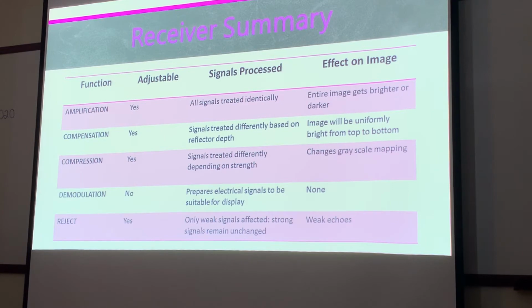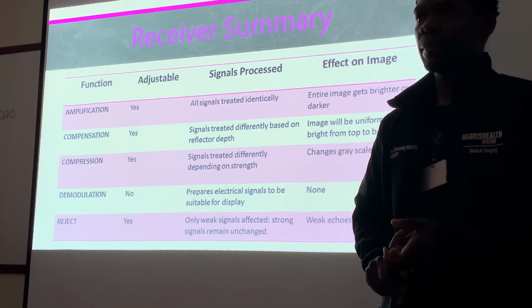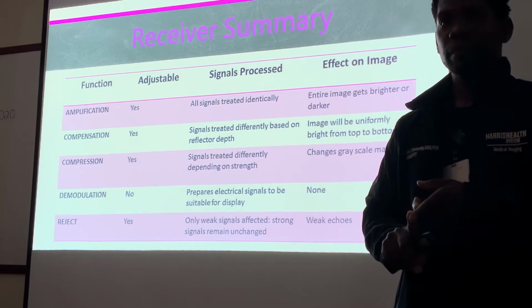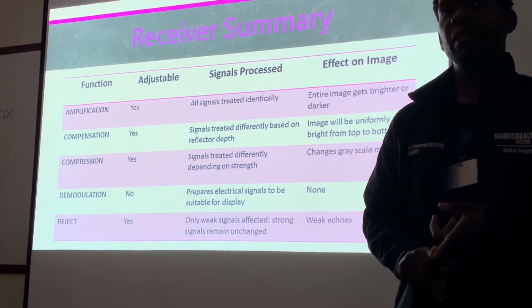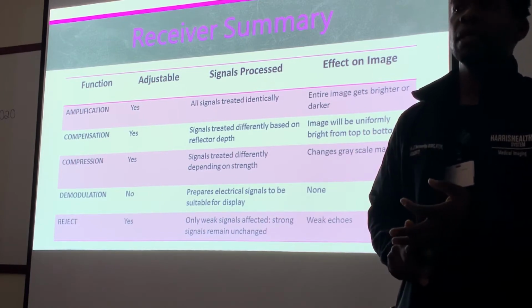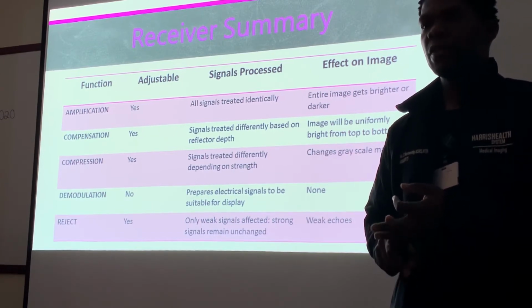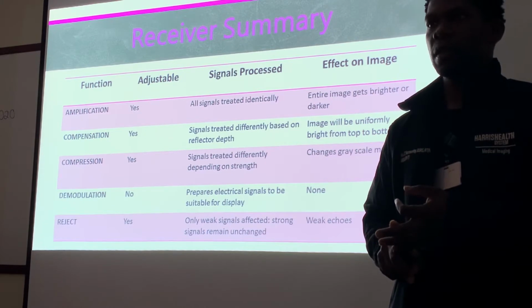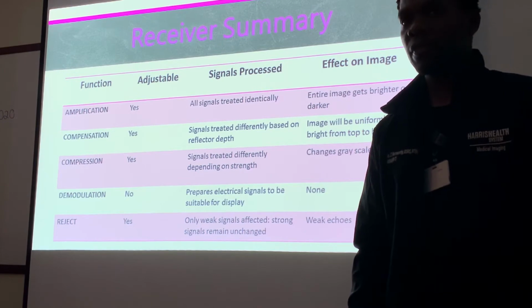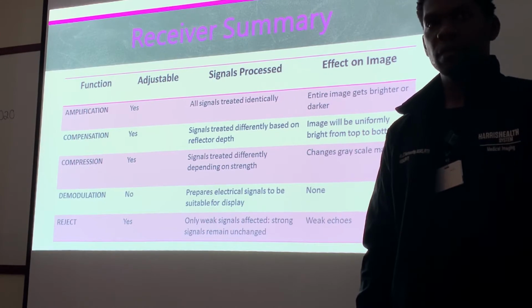Okay. So over this chapter we talk about the components of the ultrasound system. It's 7 of them, right? We already talked about one in depth, which is the transducer. We just got finished covering the pulsar, the beamformer, and the receiver, which are actually all within the ultrasound system itself. Any questions on those things? Any one of our receiver functions? Anything about pulsar, beamformer? Remember, you have a test on Wednesday, so please ask me questions.